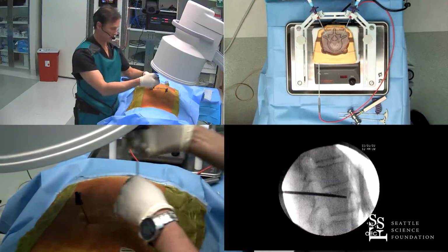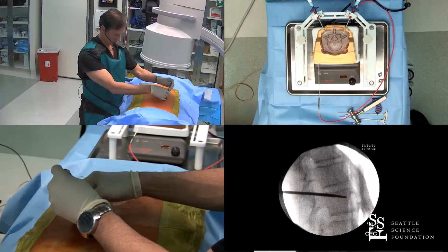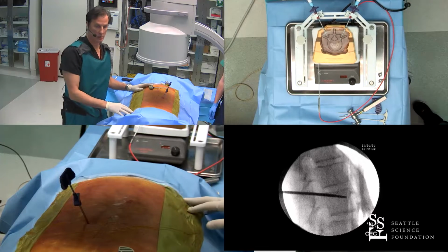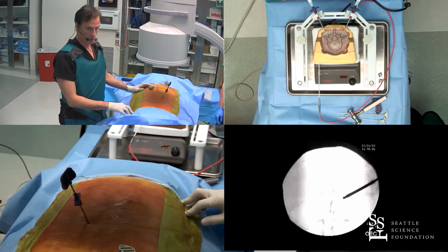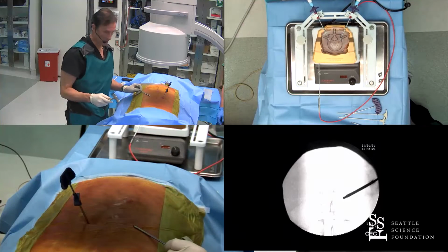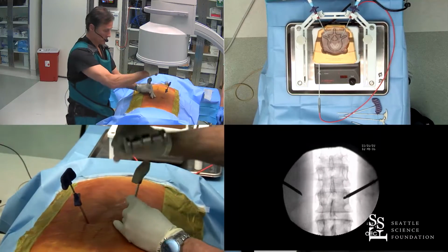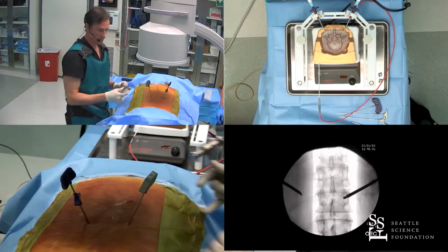So you're using that drill device to create a cavity and obtain some room for the balloon, correct? So once the drill is drilled out to the front portion of the vertebral body, we have room for the balloon. And on radiofrequency ablation, we will ablate first, and then balloon kyphoplasty second. So in this one, we'll take a similar approach, but at the 10 o'clock position, of course, because it's the opposite side.